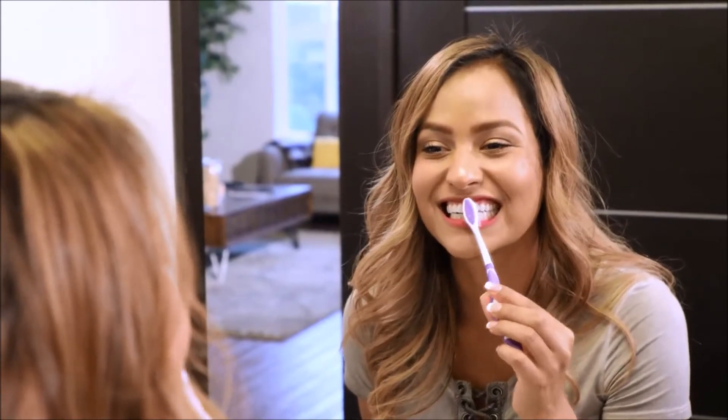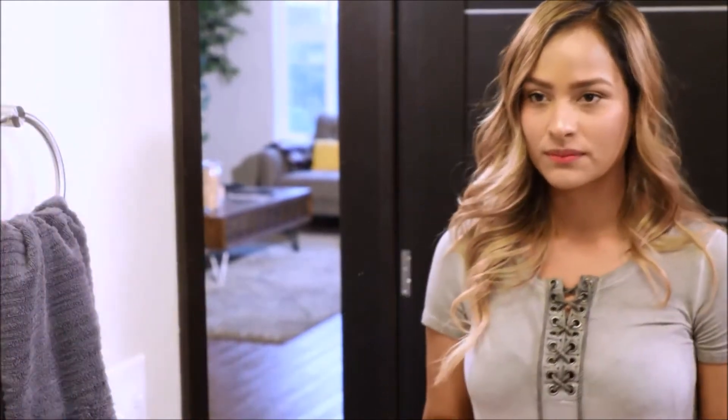Place the tray over the teeth and carefully press the tray into place. Gently wipe off any excess gel with a soft toothbrush. Leave the tray in for the period of time recommended by your dentist.